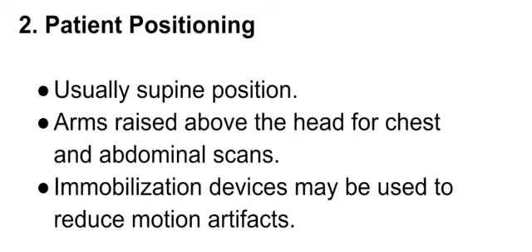In the case of a CT scan of the brain or head, we will be using a head pad so that the skull portion will not move and will be maintained in a fixed position. And usually in the case of an elderly patient, we will use an abdominal band so that the patient does not move during the complete scanning procedure. If the patient moves, there will be a motion artifact, and the scan has to be repeated for a perfect image and better imaging quality.